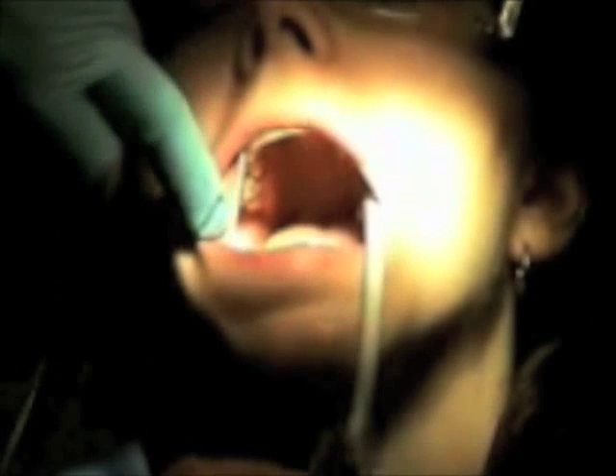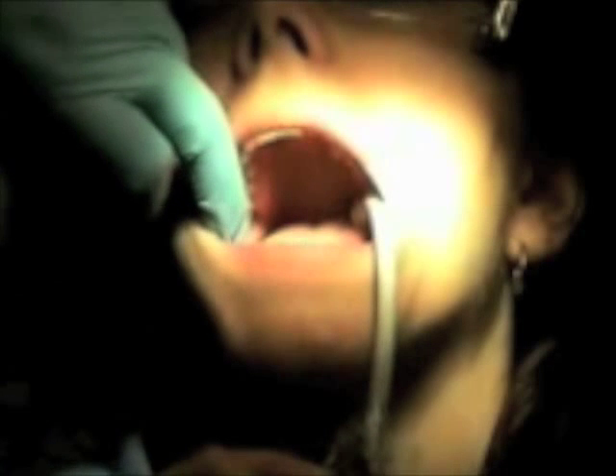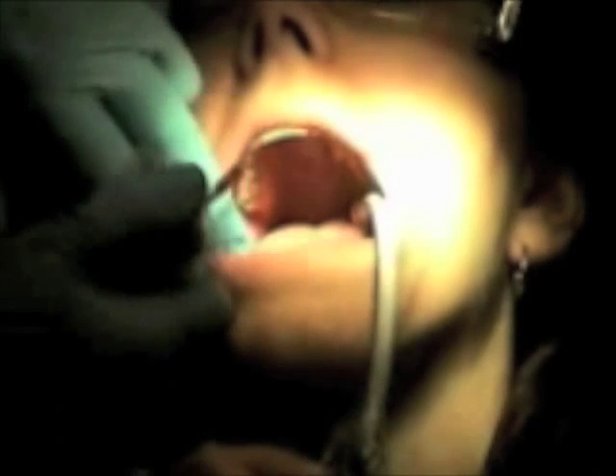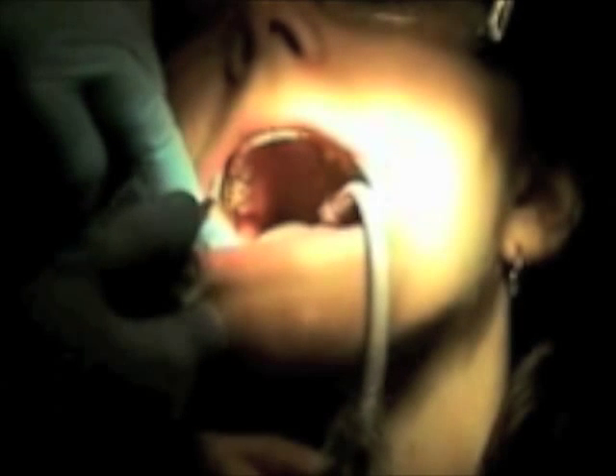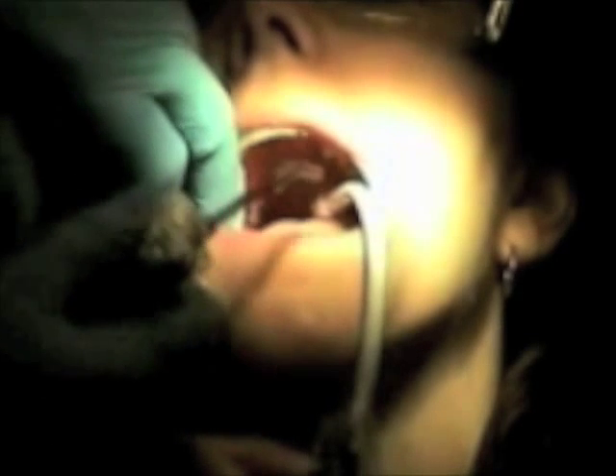To remove the dry angles, we will need to wet them first to prevent pulling on the buccal mucosa. A little water is placed in the patient's mouth to help with removal.